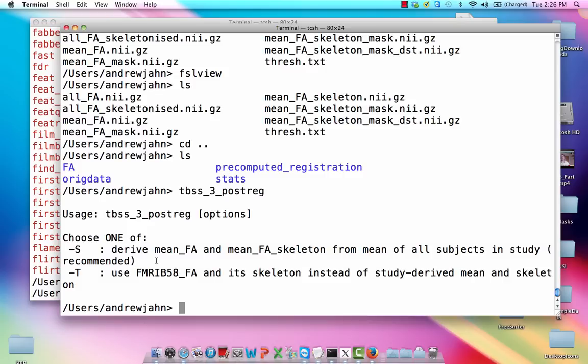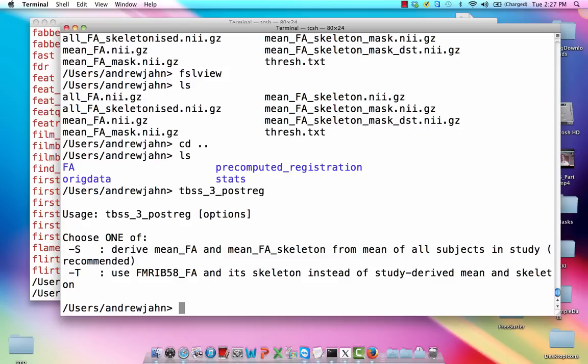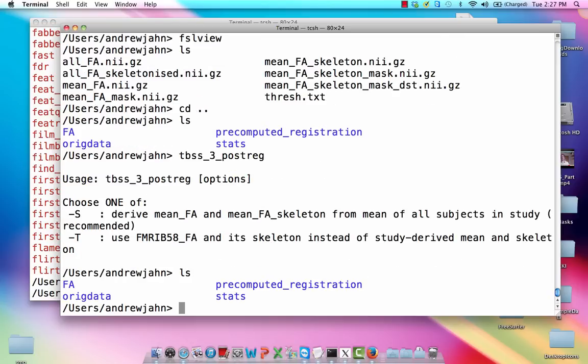but you can use whatever you want, compare, just do whatever. I don't think it's that big of a deal. So if I did run that, again, this takes a long time and I already have this all processed. But if I were to do that, we'd have this new directory right here called stats.